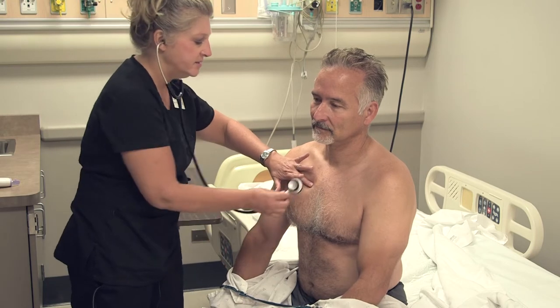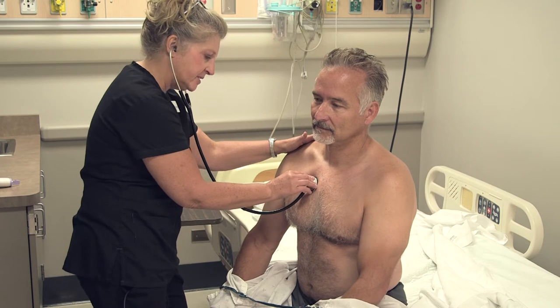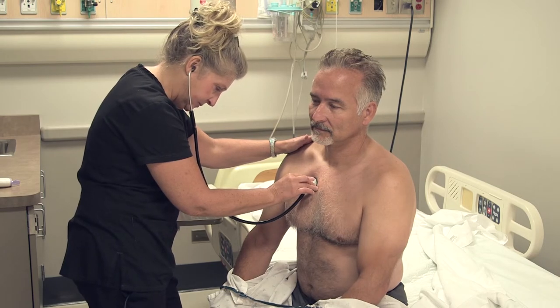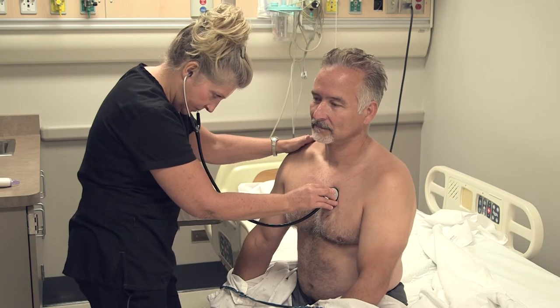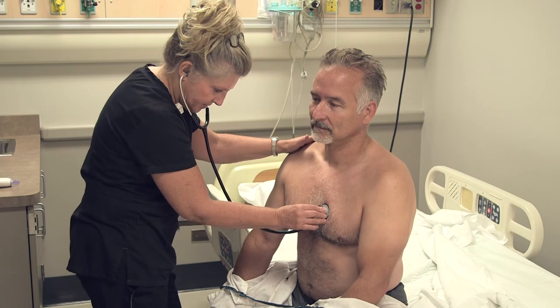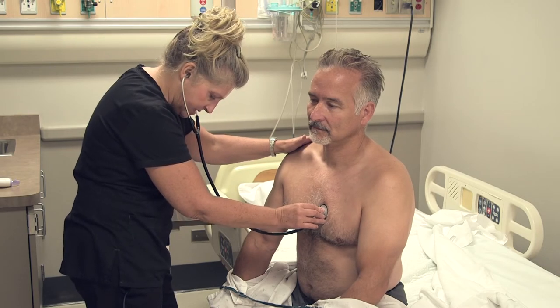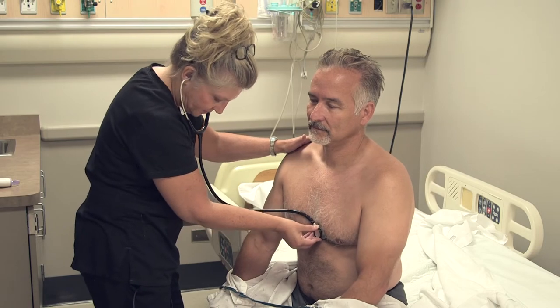So I'm going to go down to his second intercostal space. You can just breathe normally, Tim. It might seem that I'm listening for a long time, but don't be alarmed. So as I'm listening for any murmurs or extra heart sounds, I'm also paying attention to the rate and the rhythm. Everything sounds good.